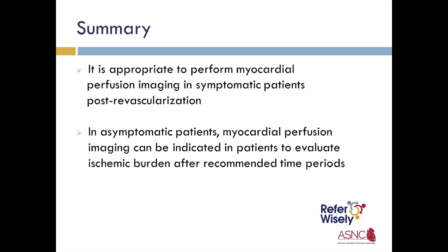To summarize this case and discussion of stress testing post-revascularization, in a patient who's symptomatic, it is appropriate to perform myocardial perfusion imaging independent of the timing after revascularization. In asymptomatic patients, however, myocardial perfusion imaging can be indicated to evaluate ischemic burden after recommended time periods that are dependent on the revascularization approach that was used.